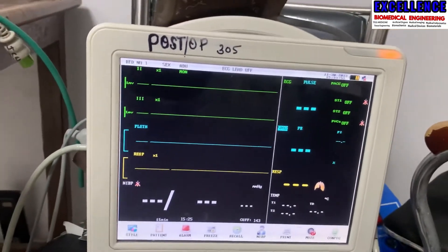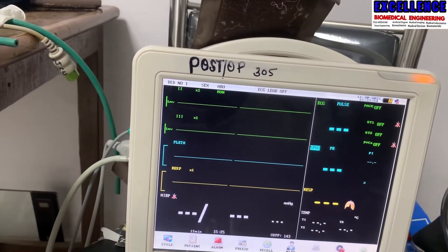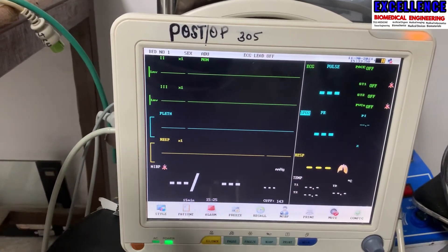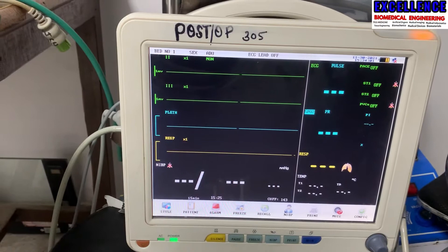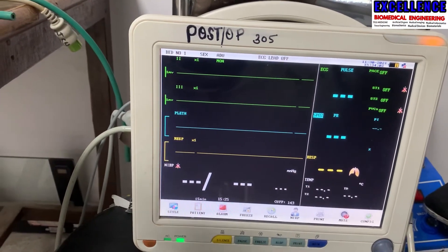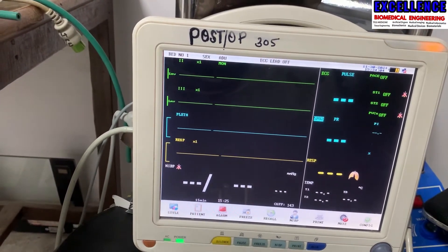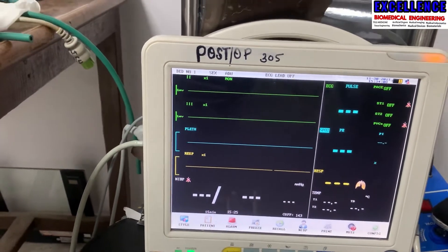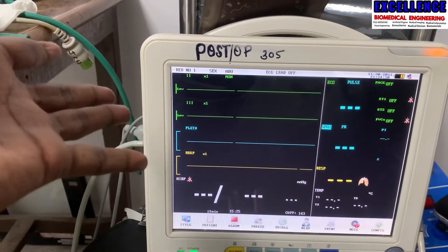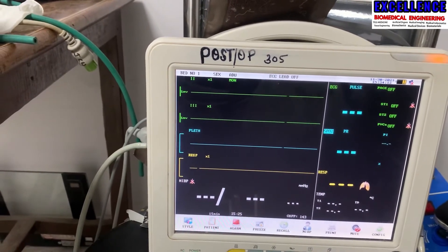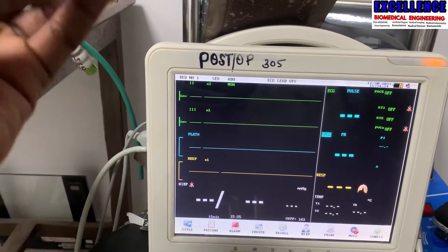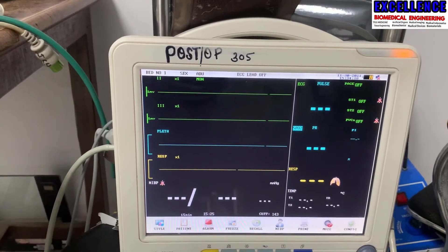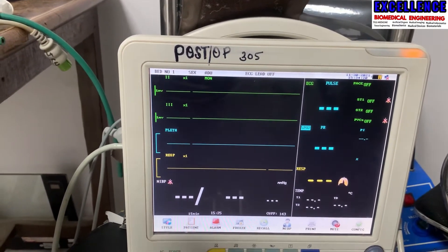This is a multi-parameter patient monitor. There are different types — we have one-parameter, two-parameter, three-parameter, five-parameter, and seven-parameter monitors. So if I could ask you: how many parameters does this monitor have? By looking at this screen, how many did you see?